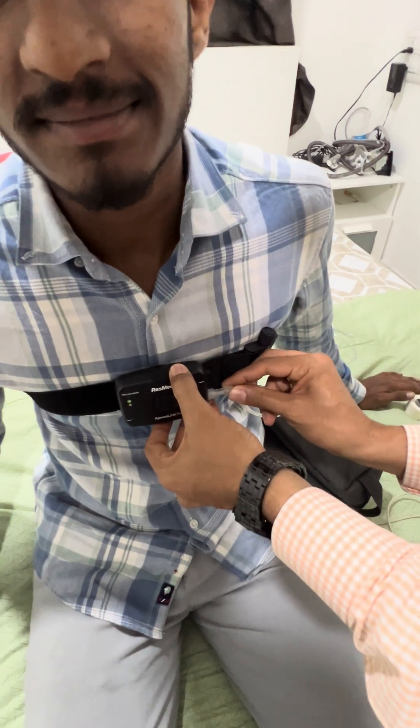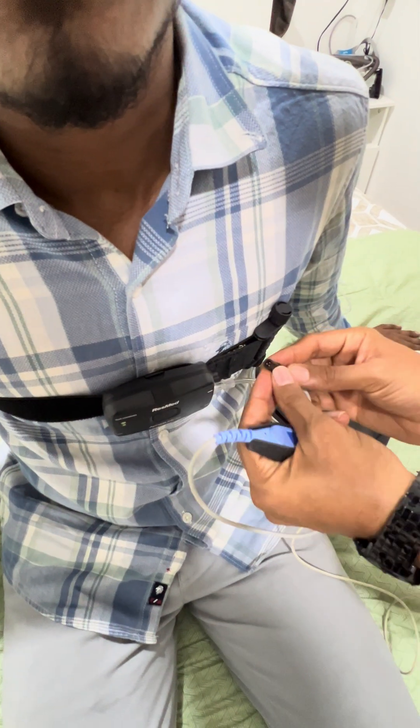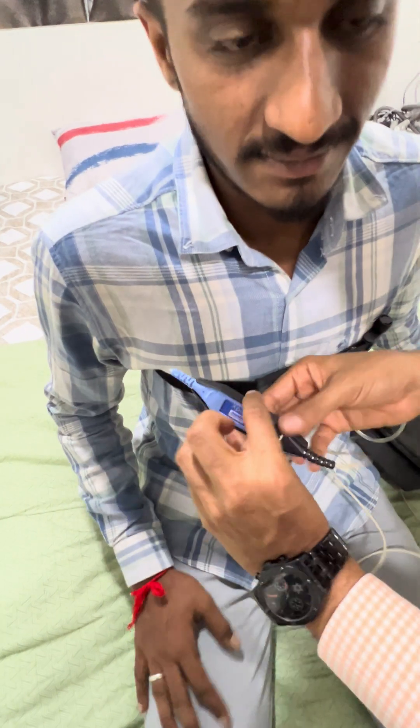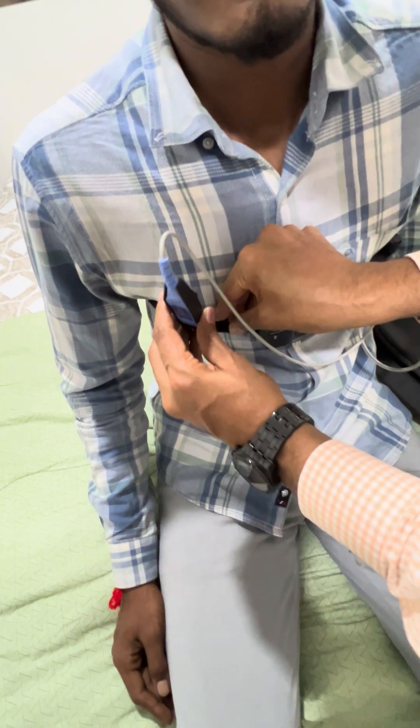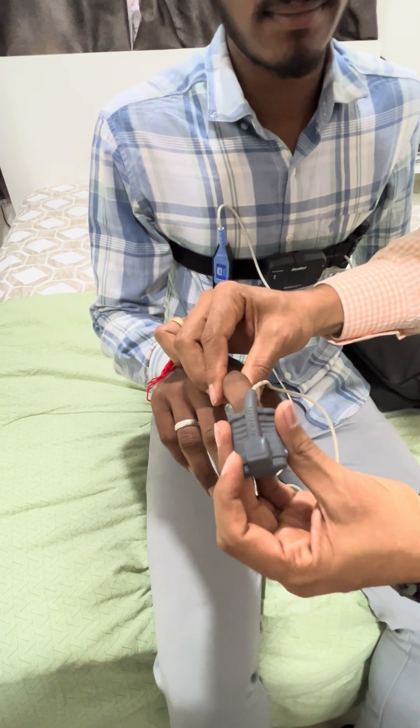Next, connect the pulse oximetry probe. There is a notch and you have to just push it inside. The clip is to be placed towards the opposite side. Then place the pulse oximetry probe onto the index finger.